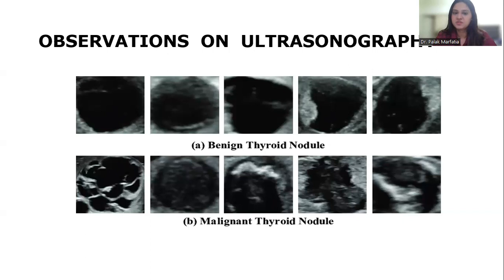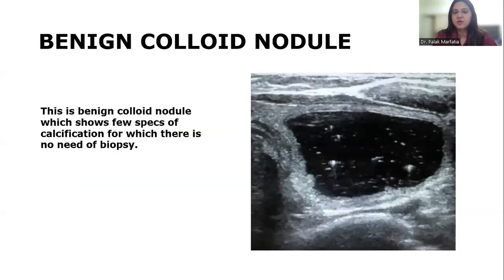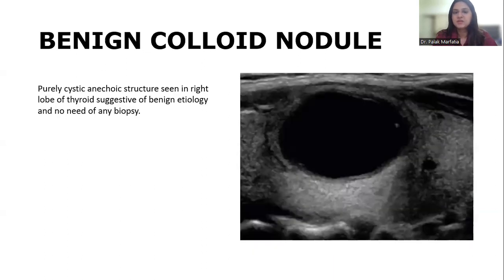Observations of Ultrasonography. This is how a benign thyroid nodule looks and this is how a malignant thyroid nodule looks. Benign colloid nodule: this shows few specks of calcification, for which there is no need of biopsy. Another benign colloid nodule: a purely cystic anechoic structure seen in the right lobe of thyroid, suggestive of benign etiology, with no need of biopsy.